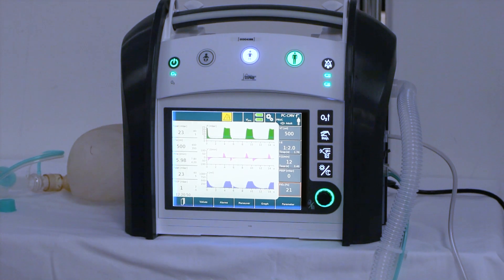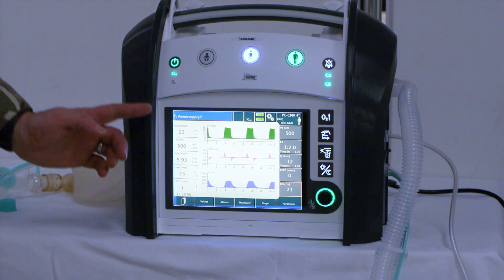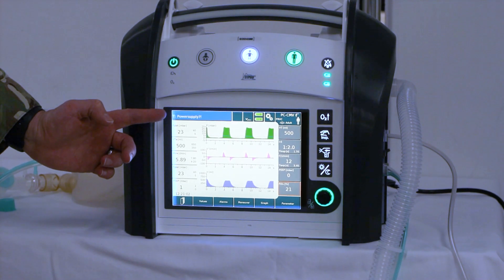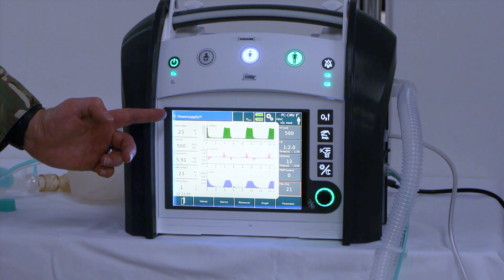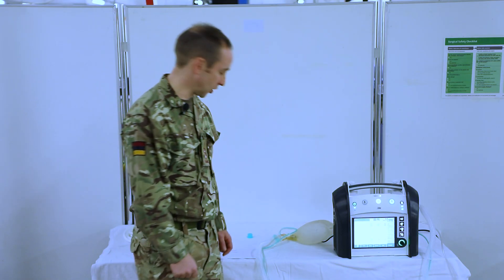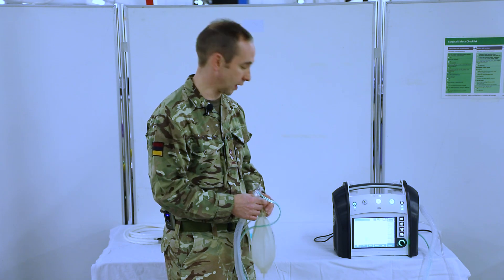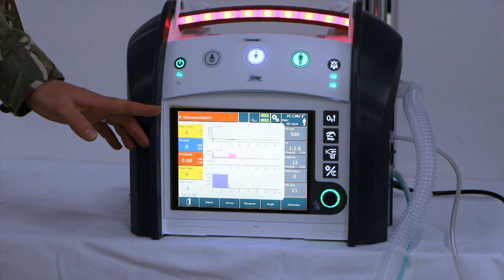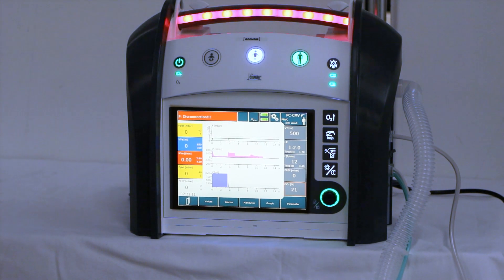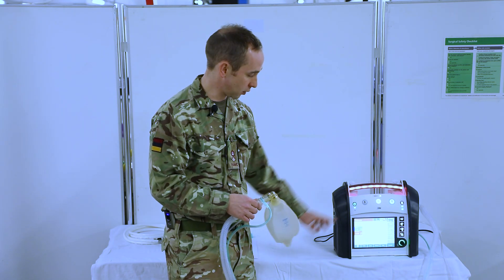Next, we're going to check the external power supply. We will disconnect the device from the external power supply — at this stage we should get a blue alarm which says 'power supply' with an audible alarm. We then reinsert the power and the alarm should disappear. We'll then do a disconnection check: take the test lung and remove it. At this stage we should get a red alarm which says 'disconnection' with an obvious audible alarm, and a highlighted red alarm at the top on the bar. When we reconnect, after a few seconds that should then disappear.